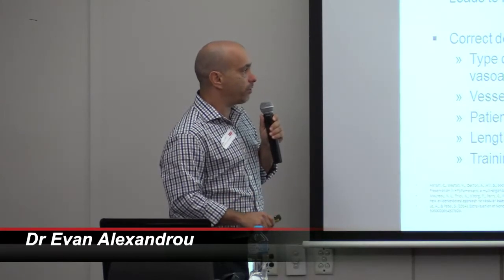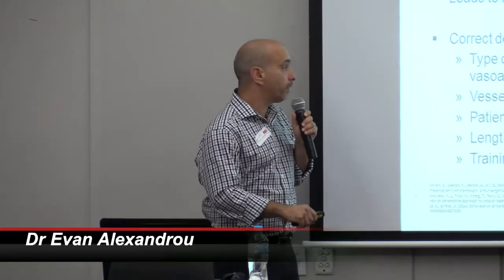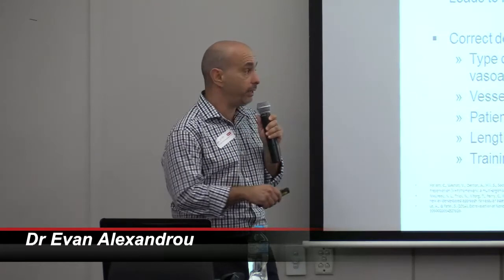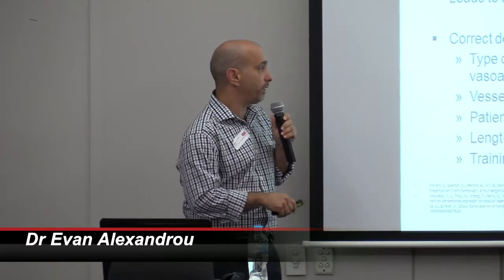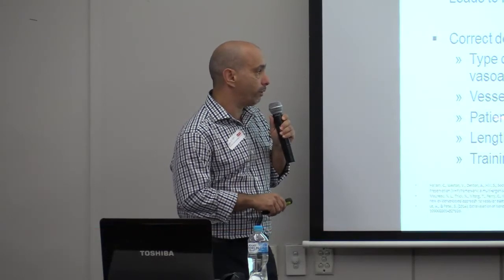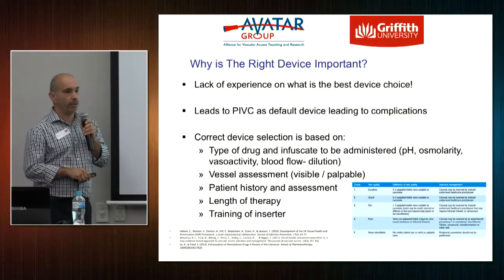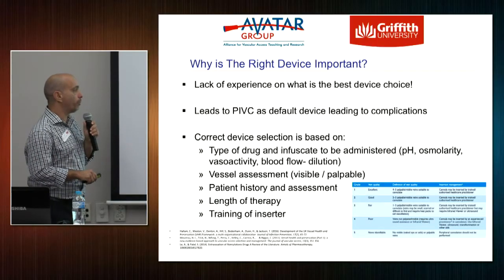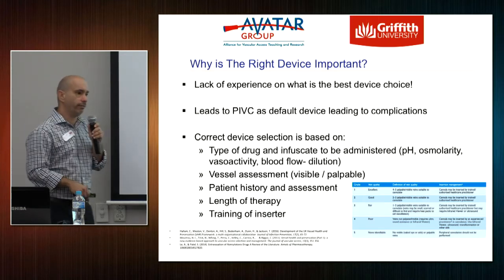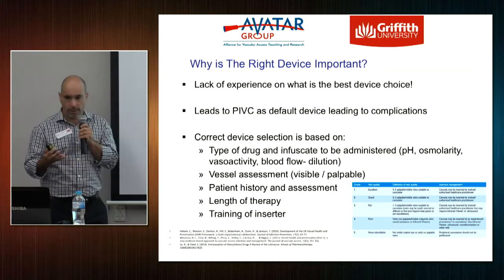So thinking about the history and assessment of that patient, have they had a history of difficult access in the past? Do they have any clinical problems which are going to impede the use of a particular device? The length of therapy. Now, the longer that therapy is for will hopefully determine what type of device that patient will need. And of course, the training of the inserter. The more you do, the better you get.